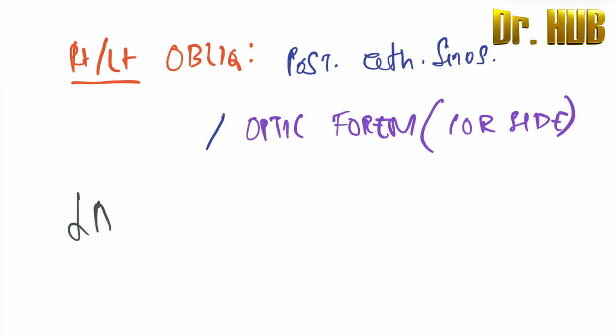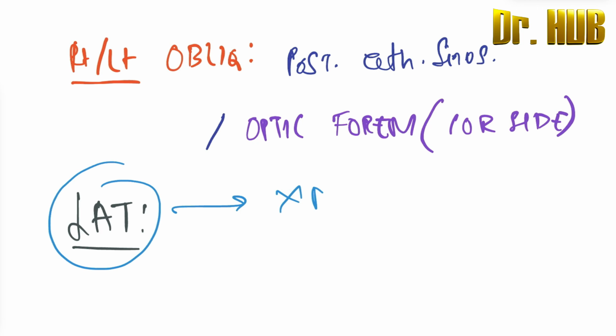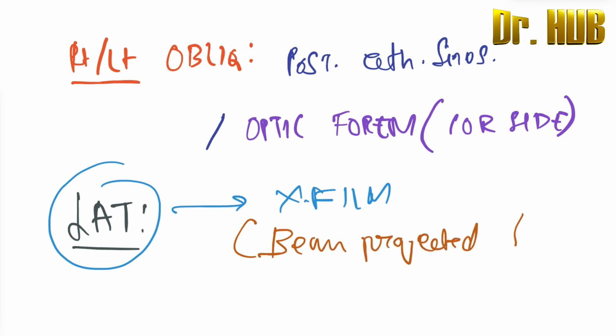Lastly, we look at the lateral view. In the lateral view, the lateral side of the skull lies against the X-ray film, and the beam is projected perpendicular from the other side.